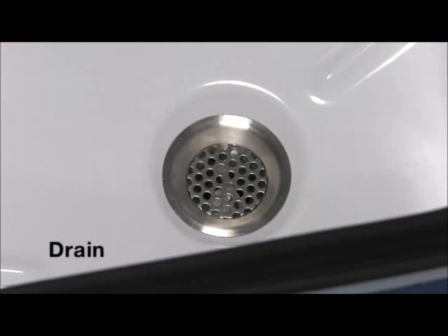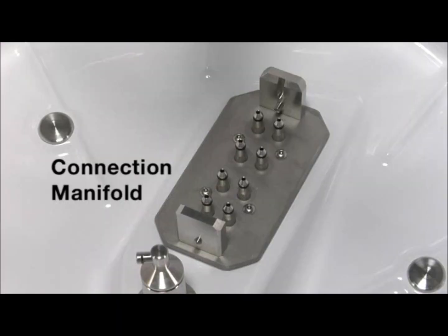The drain discards waste fluids. The connection manifold attaches the endoscope hookup blocks to the monitoring system. The connection manifold dispenses fluids and air through the channels of the endoscope.